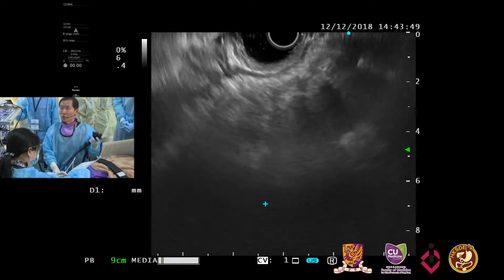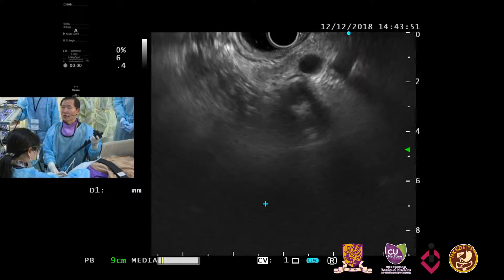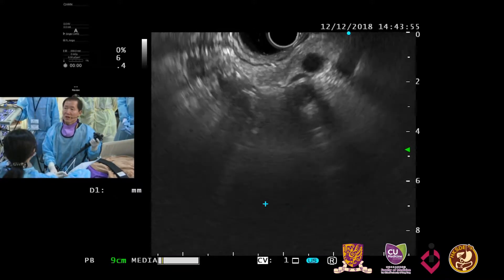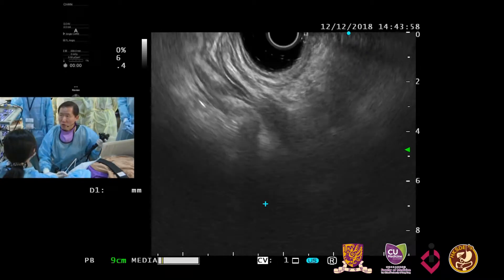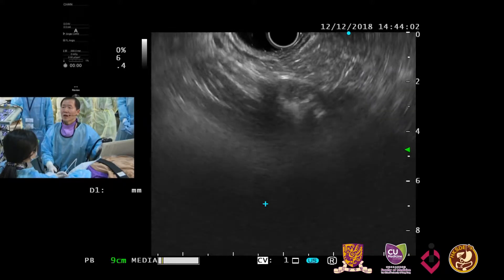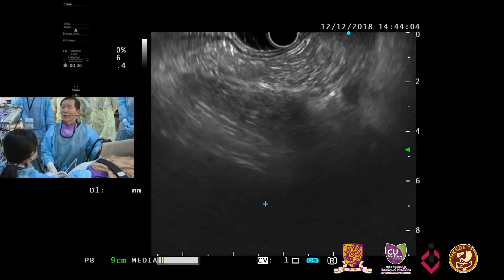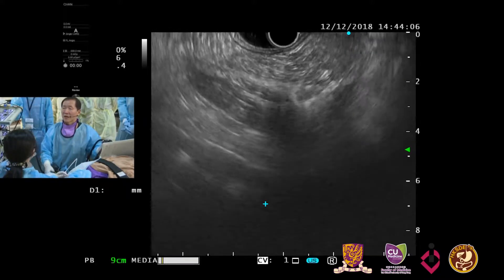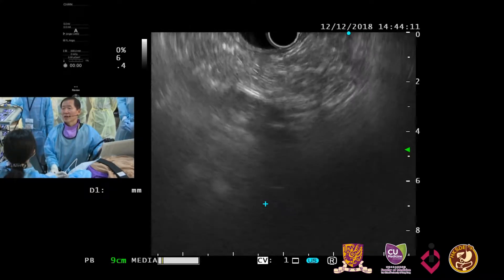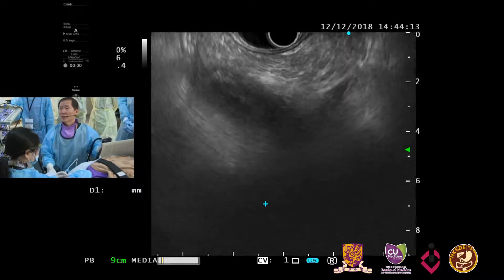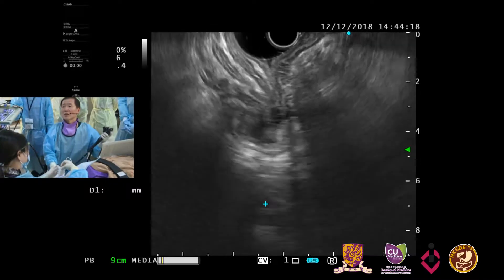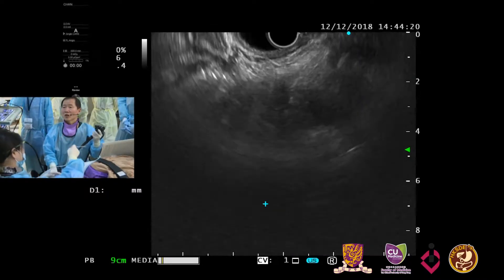Now I'm trying to move my scope back to the stomach. This is the aorta, the celiac, and the splenic artery and vein. If I rotate further counterclockwise, then generally here we can see some of the left lobe of the liver. This is the position where we must observe the left lobe, but we cannot see it here because it has already been resected.